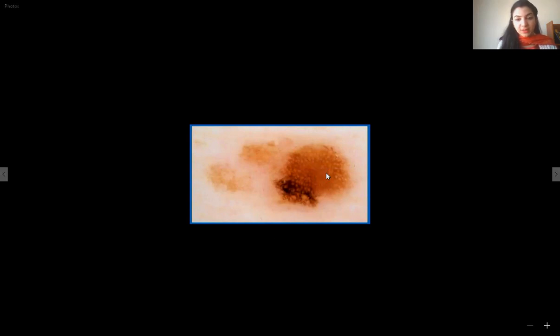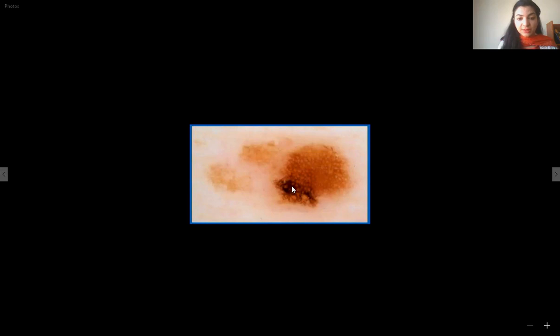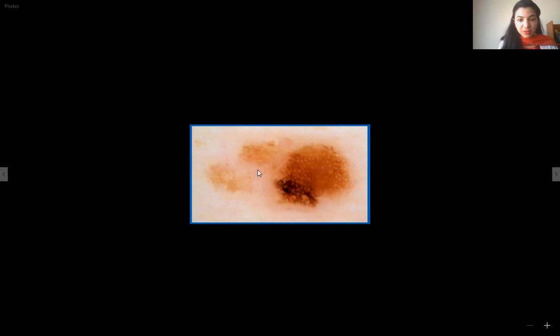Going towards the next lesion: there is a network pattern of two kinds. The normal network pattern has thinner lines than the areas enclosed by them. However, on the bottom side of the picture, the thickness of the lines is greater than the areas enclosed — the holes enclosed are smaller and it appears much darker. This is the abnormal pigment network, also called the atypical network. This lesion qualifies for melanoma, with another visible feature being the structureless pattern in the periphery. So this is another melanoma.